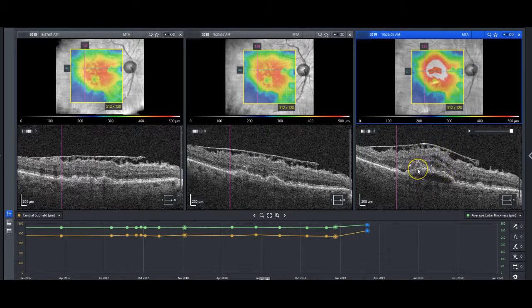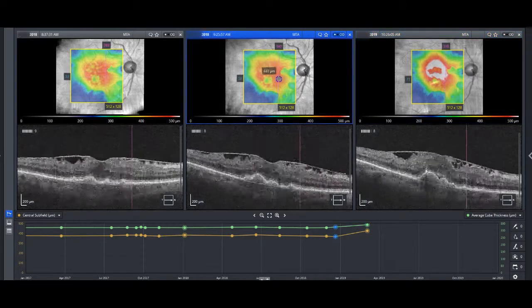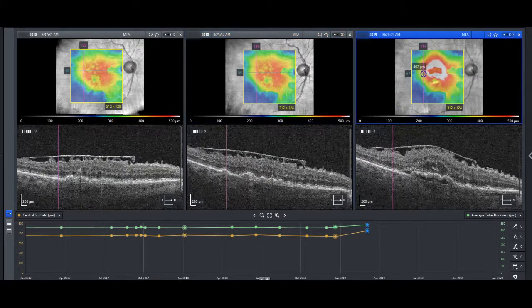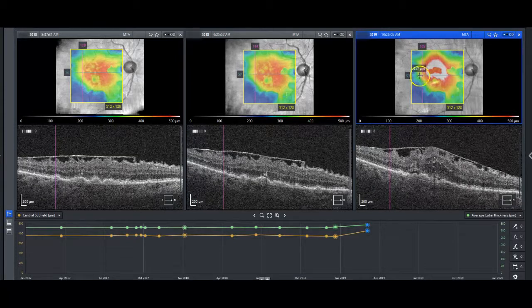But the point is that the conversion and the ability to find that conversion is very important, because you're definitely going to have at times these patients that have these larger epiretinal membranes that cause some degree of retinal thickening, but you need to be able to note when things are actually worsening to a point where they have choroidal neovascularization and need anti-VEGF injections. Well, I think that's all pretty interesting.